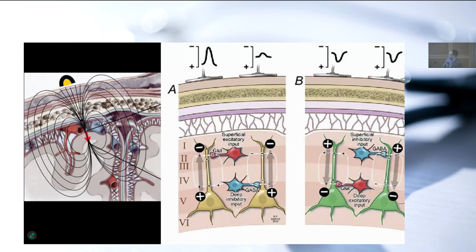What are we measuring? Well, unfortunately, the EEG is measuring only the cortex. The reason for that is that in the cortex, all of the pyramidal neurons are arranged in this perfectly linear fashion. So when you get volleys of electrical information, they can be summed spatially because all the little wires are parallel. Whereas in the rest of the brain, all the wires are kind of crossed in a funny way, and so electrical activity nulls out and you can't measure much. And so it is the summated postsynaptic potentials that give us EEG.